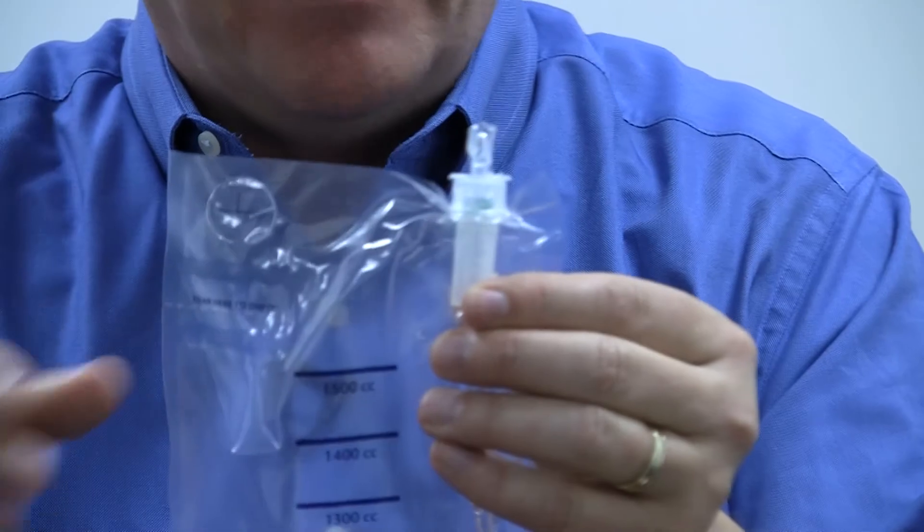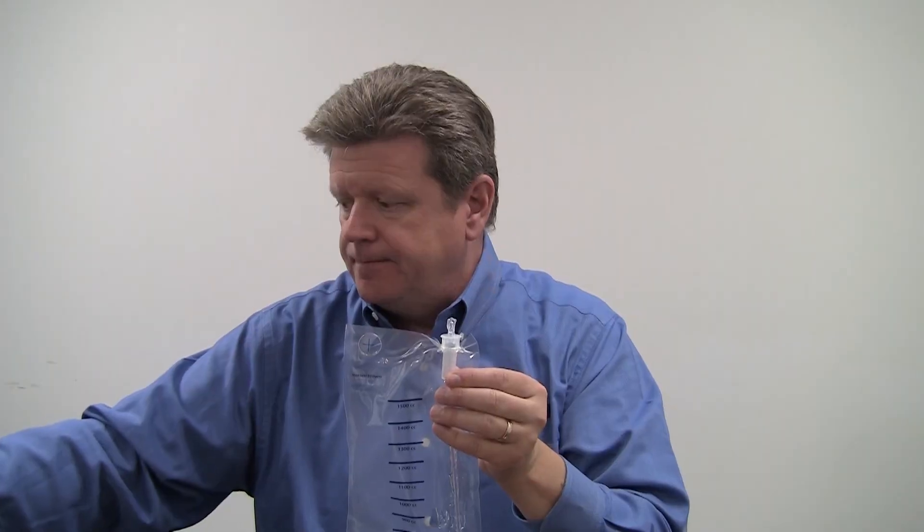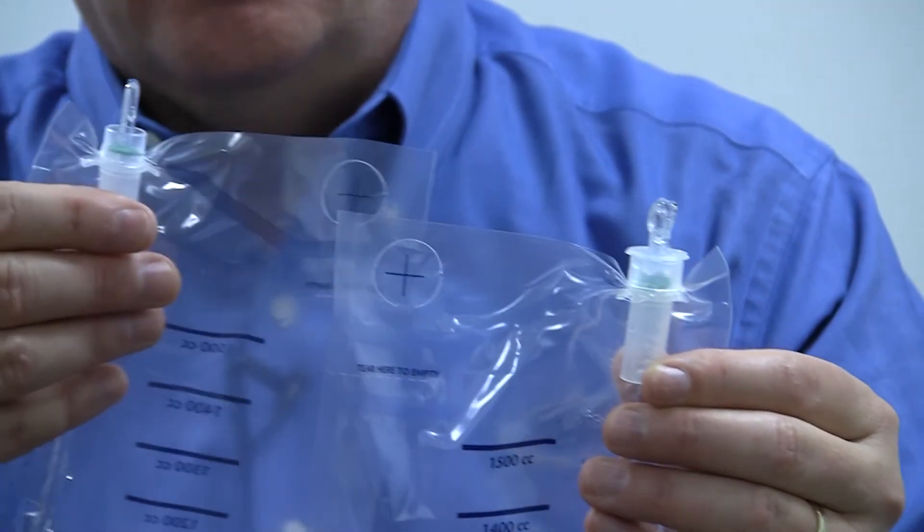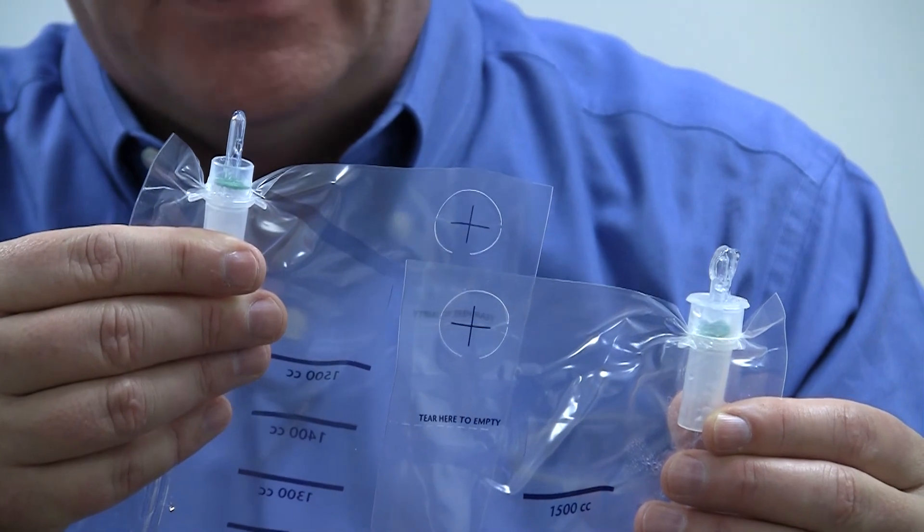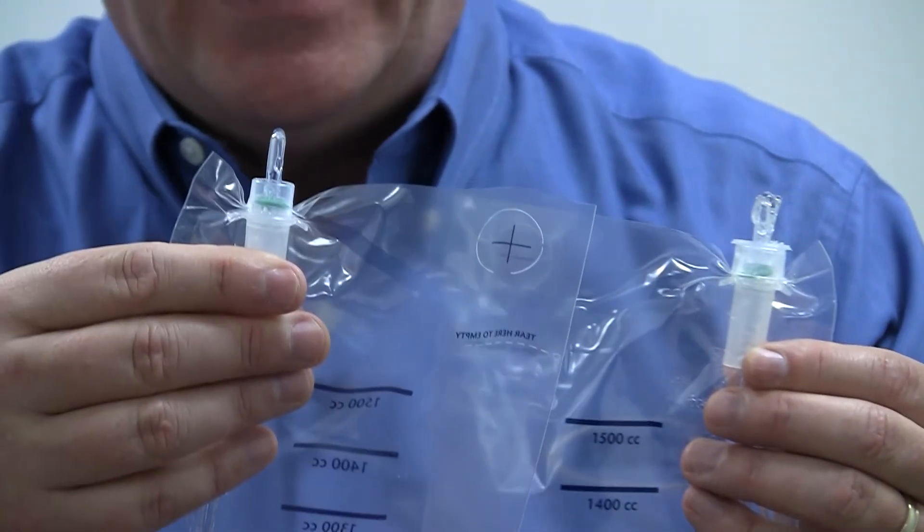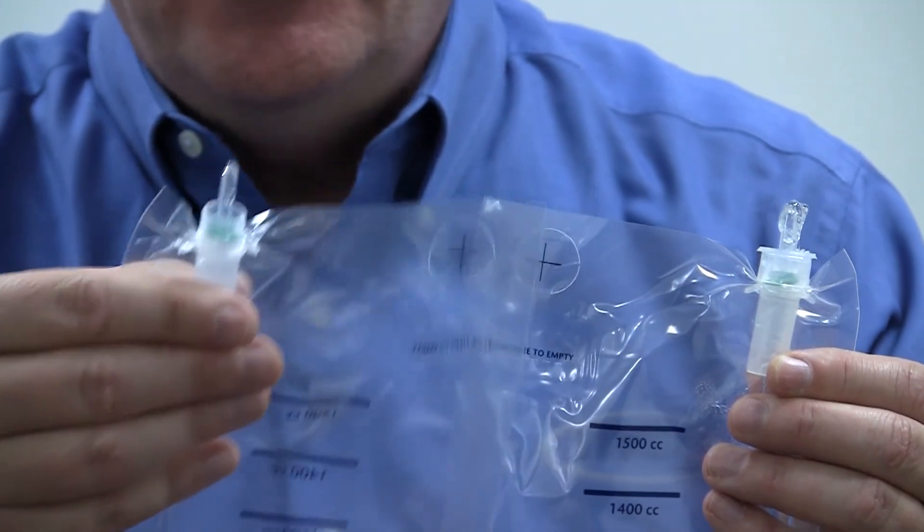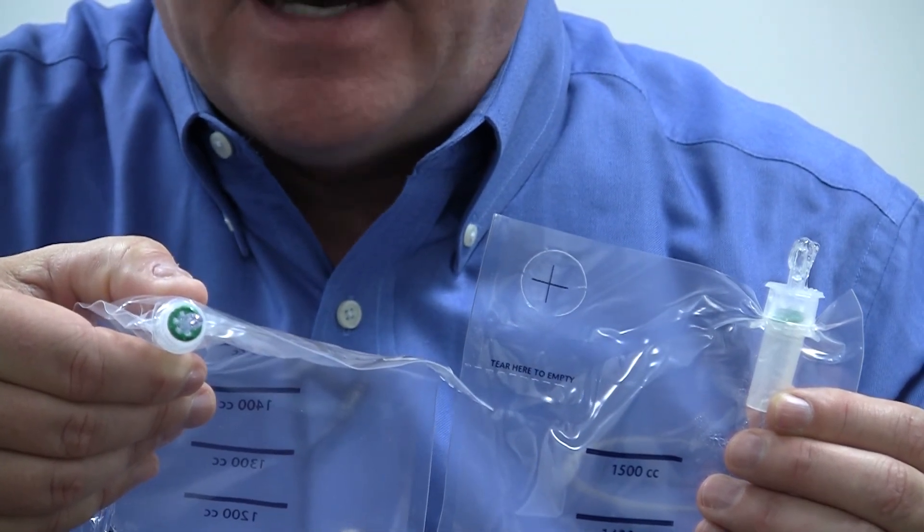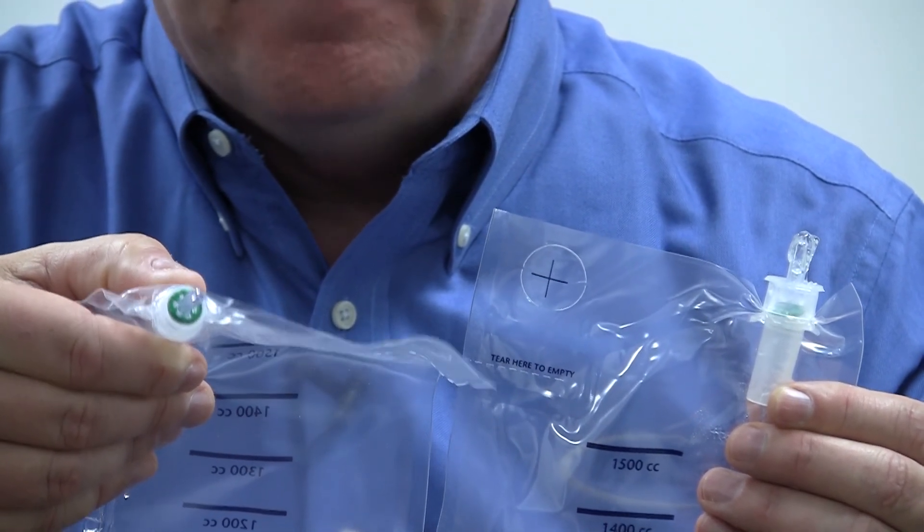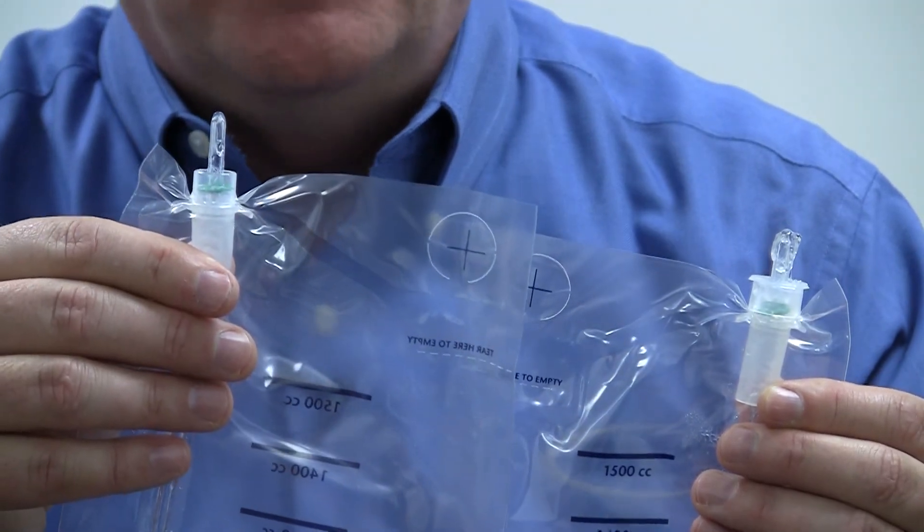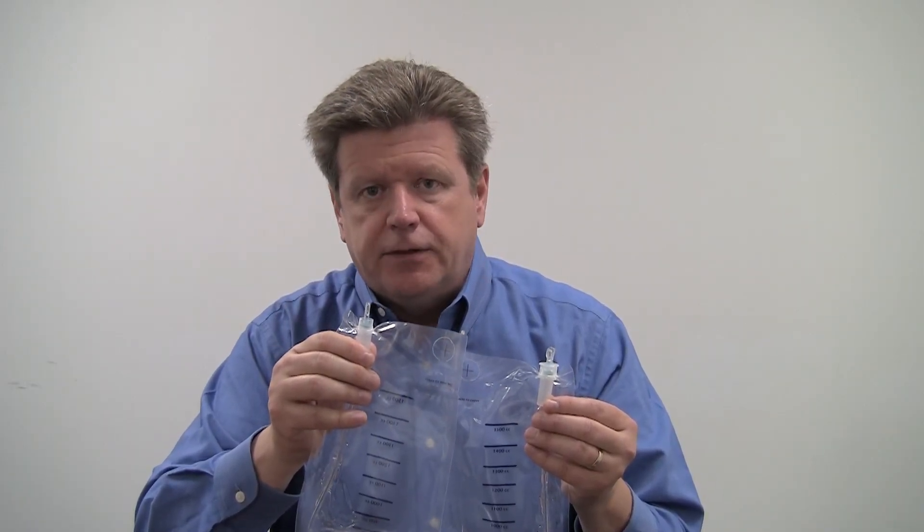This one here that's now in my left hand is correct. I'll show you one here that we have taken the introducer tip completely off of. The one in my right hand, you would not want to use. You can actually look down inside and see that the advancer valve is exposed. The introducer tip is removed. If you encounter a bag where you've taken the introducer tip completely off, discard this one and get another.